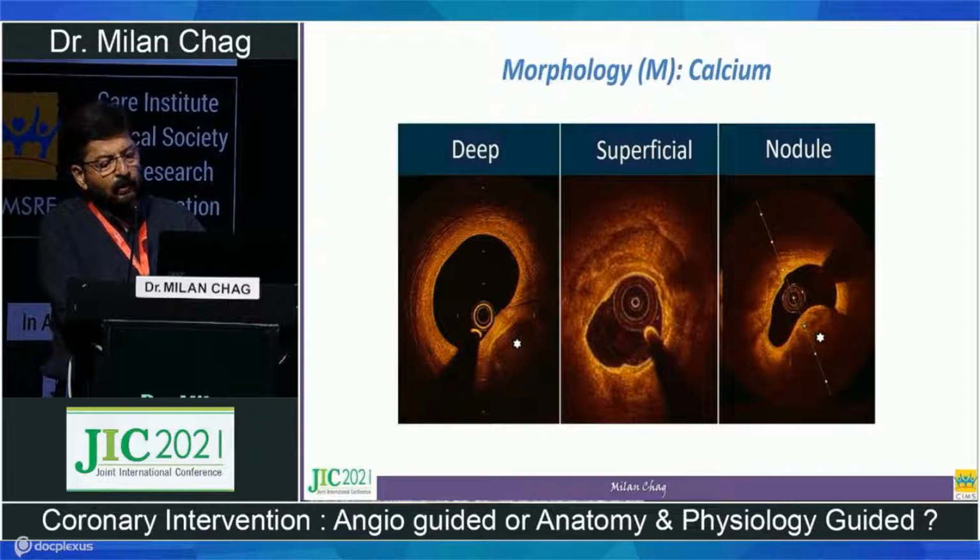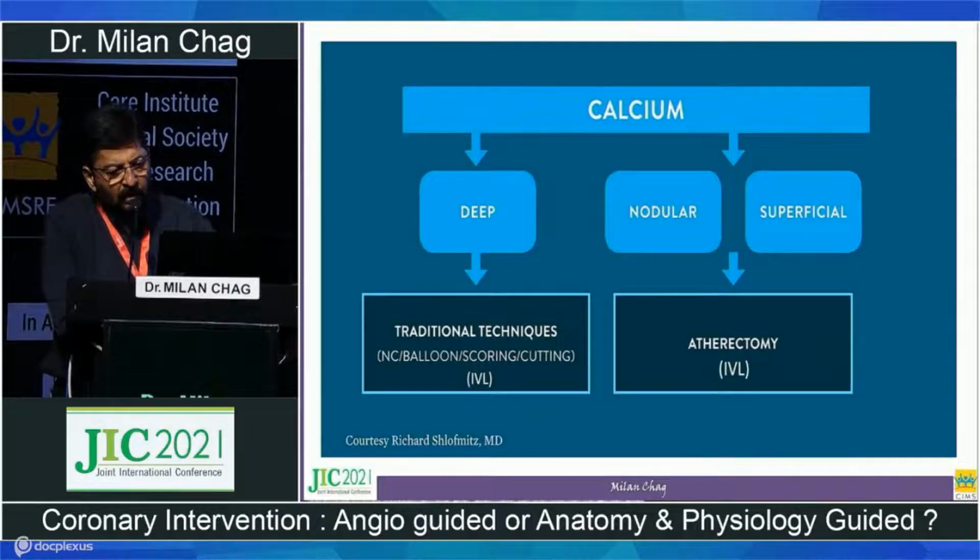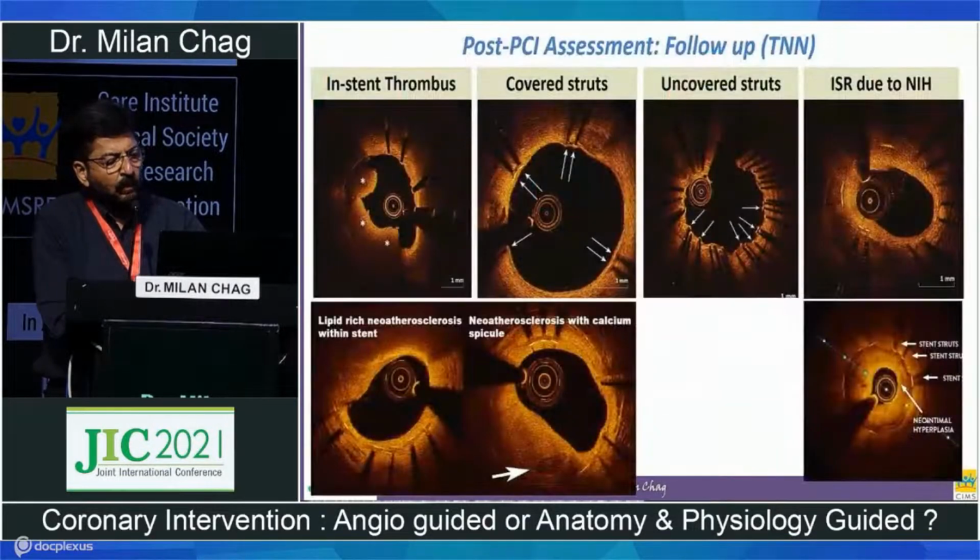This is a calcium nodule sitting like a stone. If you put a stent here, the stent will never expand. You have to treat by rotablation or rotatripsy, which we heard about in the morning. So this is the treatment protocol.